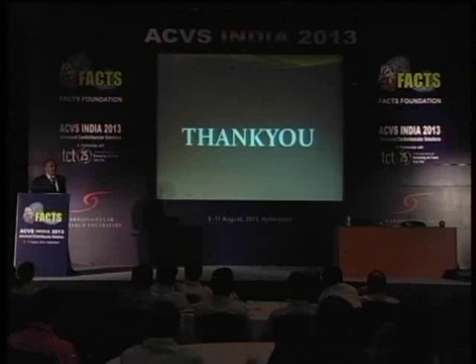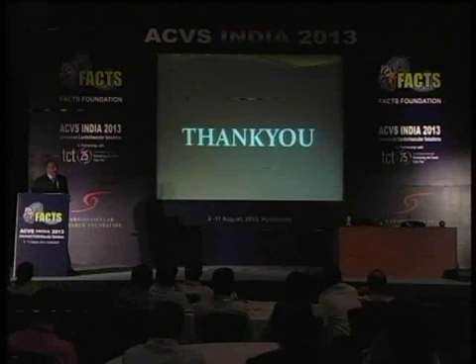Yeah, I still believe it is possible to do it, and it still can be done. There is no 100% recommendation that you cannot do a left main angioplasty in the absence of IVUS in your lab. But if you have done a good amount of IVUS, and then you take on an angioplasty without IVUS, then you will know that IVUS has helped you, and you will probably optimize your result better. But still, I think it can be done.